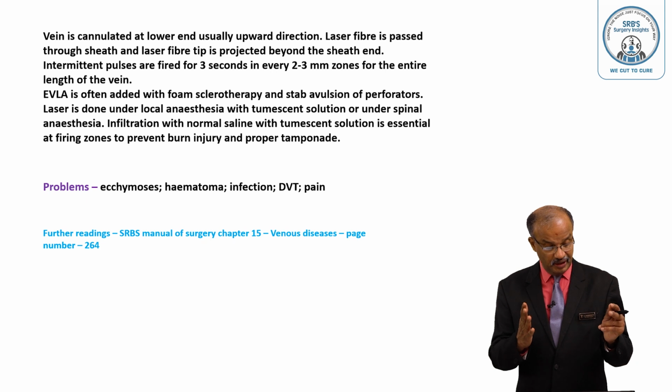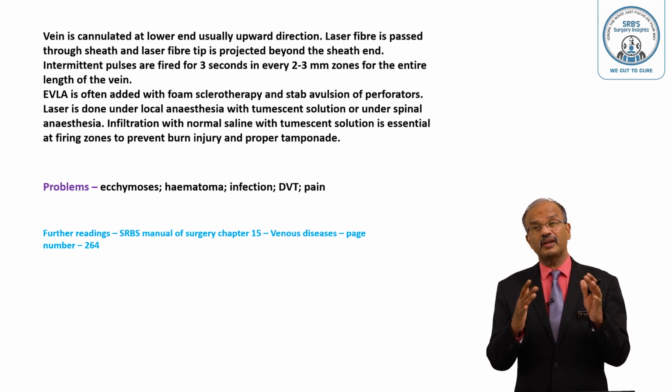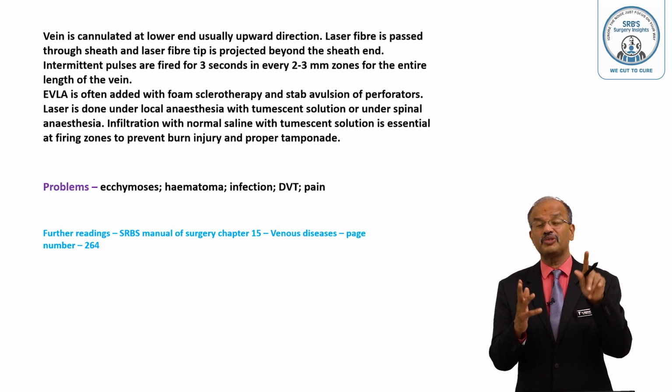So that is about EVLA, a very commonly asked question when a long case, when you present, and in Viva they will ask. MCQs will be asked, 1470 nanometer for MCQ, remember.